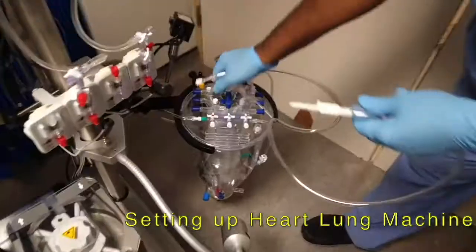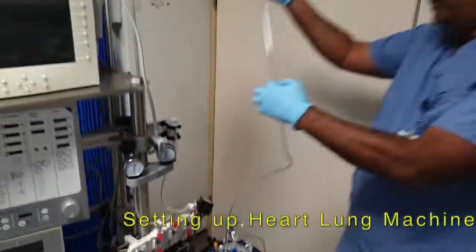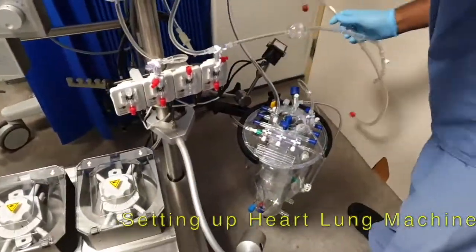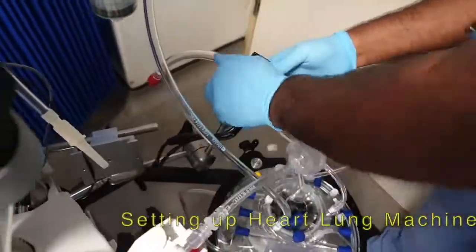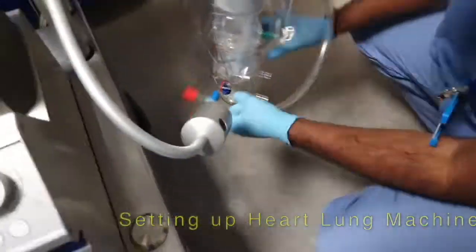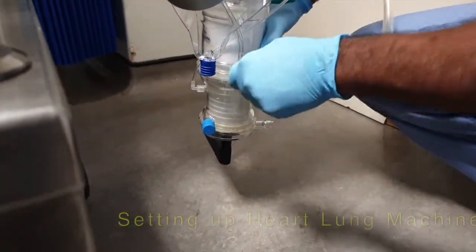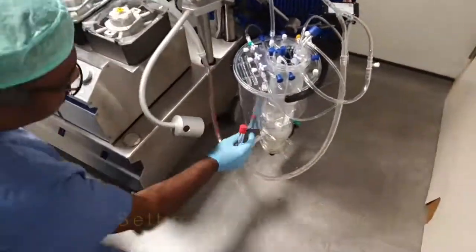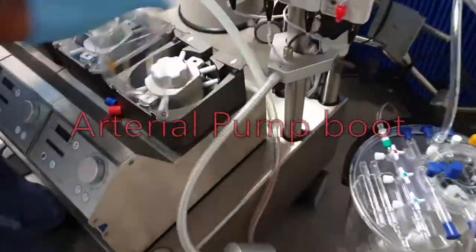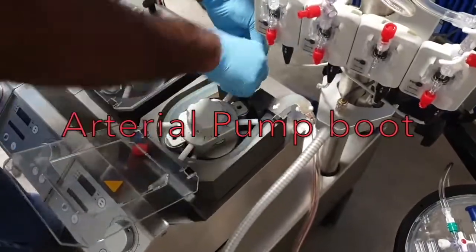All the tubing has to go in the correct direction in the precise way. This tube is rolled into the pump, which essentially acts as the heart.